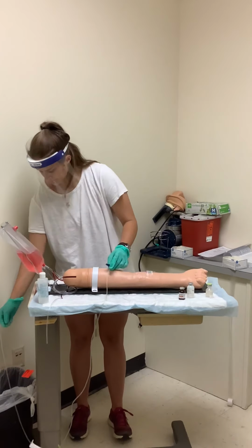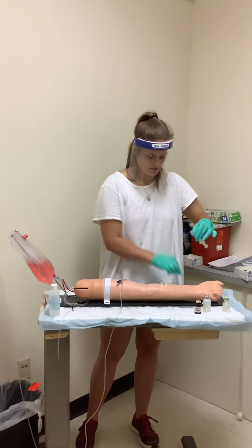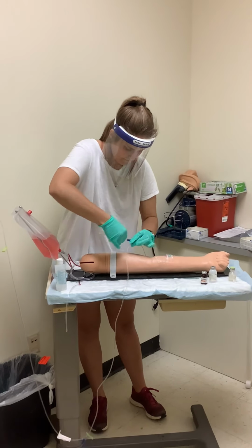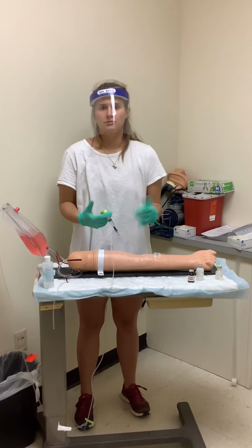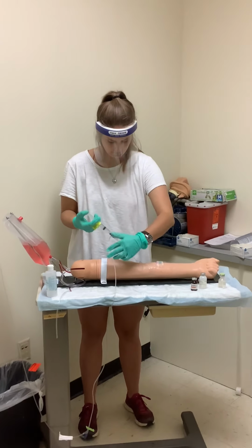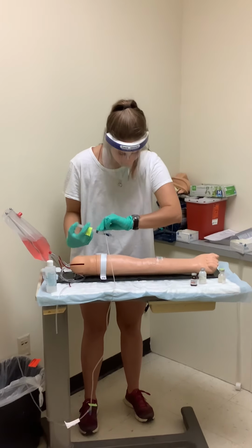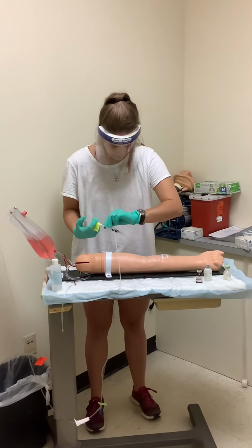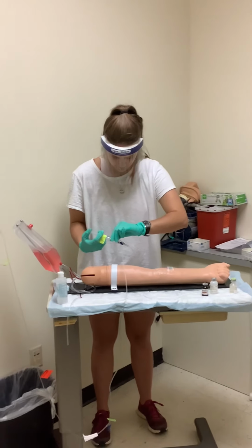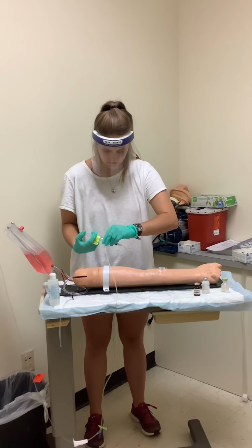Okay. And I can now grab my medication and attach it to my hub. So 4 milliliters over 2 minutes. It's going to be 1 milliliter every 30 seconds. Make sure everything's not clamped. And I'll give my first milliliter. And I'll let this go.